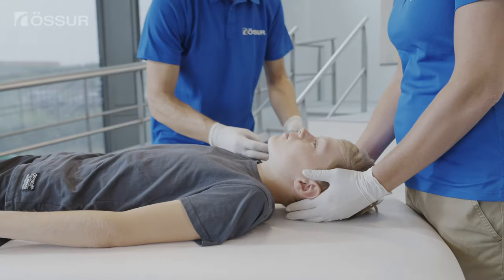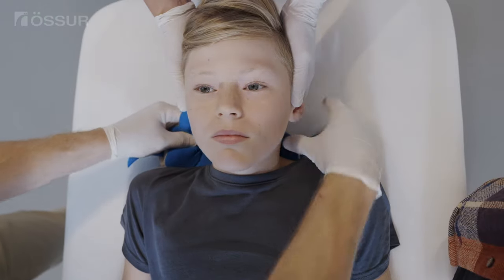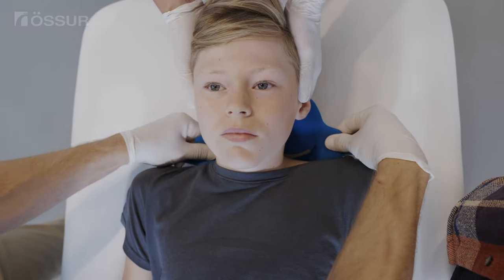If used, remove the pillow and slide the collar back behind the patient's neck and center it. Long hair should be placed outside of the plastic shell.